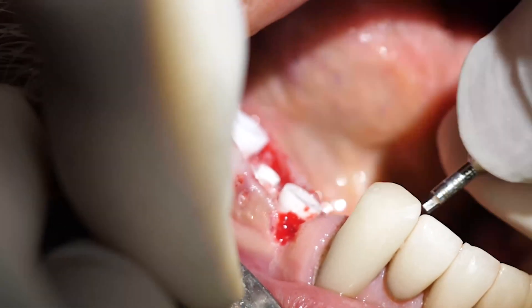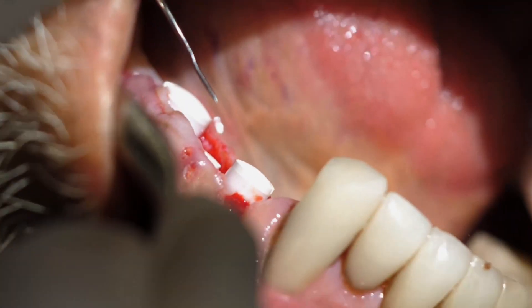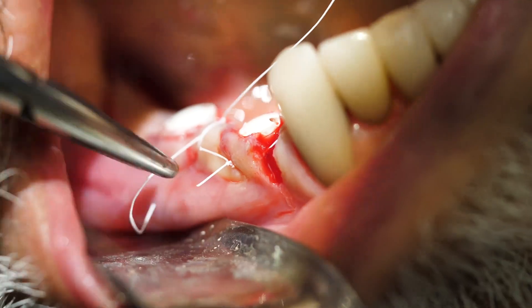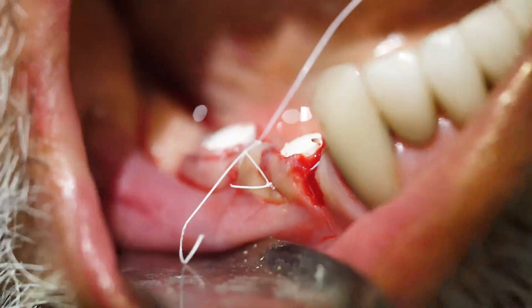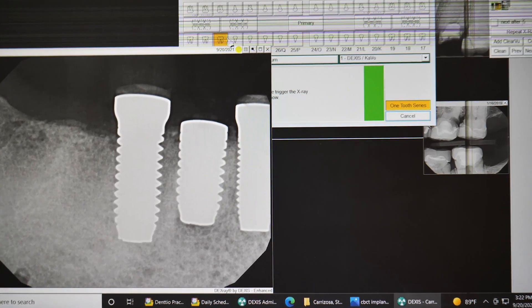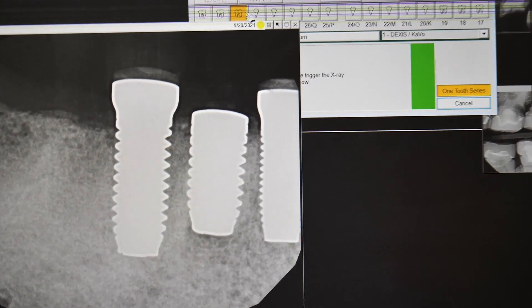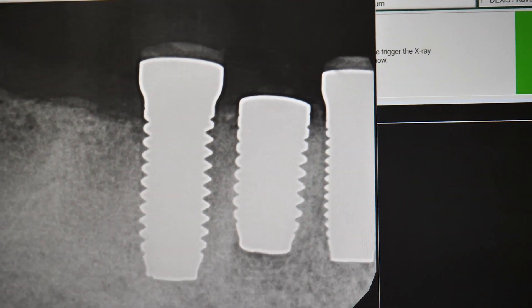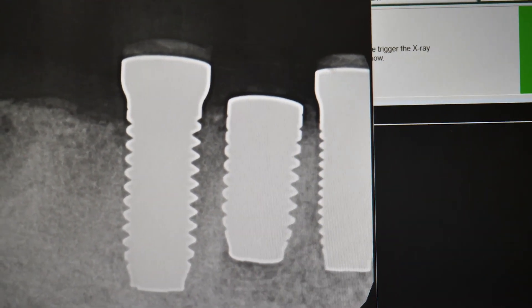At first I was planning to place gum level implants in all three sites. However, as it turned out, the osteotomies were still too close in proximity. Therefore I opted to use a bone level implant in the middle, which does not have the white collar. In the final x-ray I am totally happy that I found a way out of the proximity dilemma by adapting and reaching for a bone level implant.